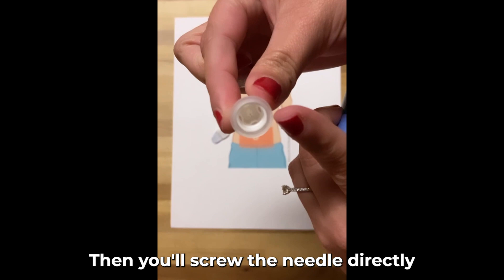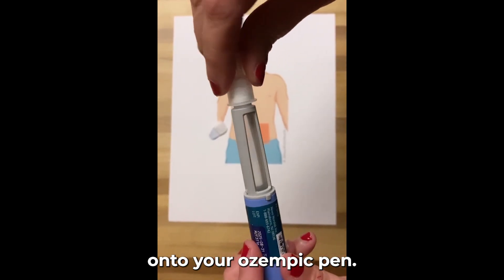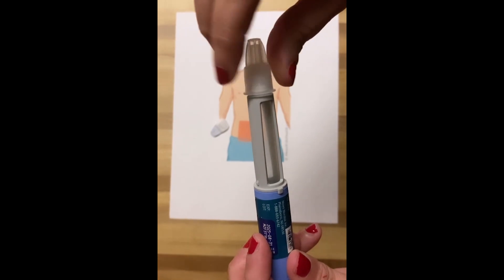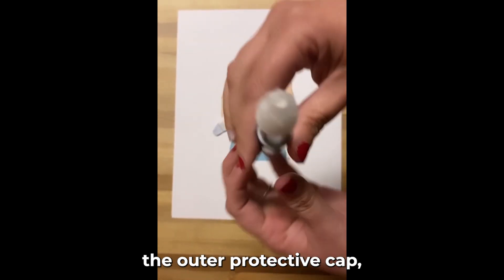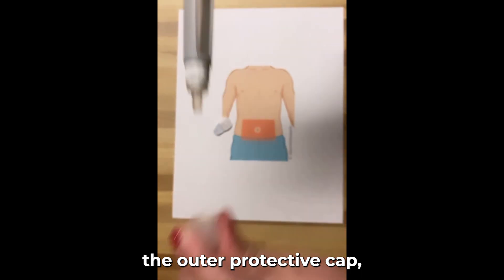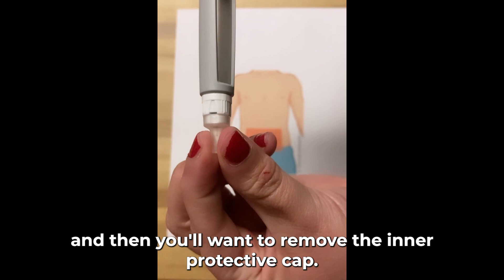Then you'll screw the needle directly onto your Ozempic pen. Then you can remove the outer protective cap, and then you'll want to remove the inner protective cap.